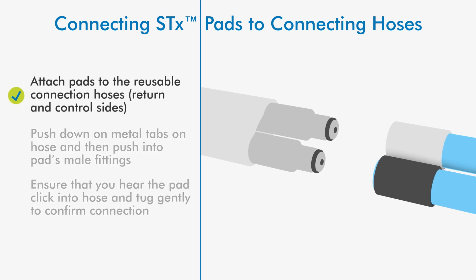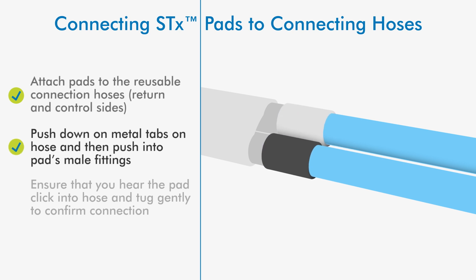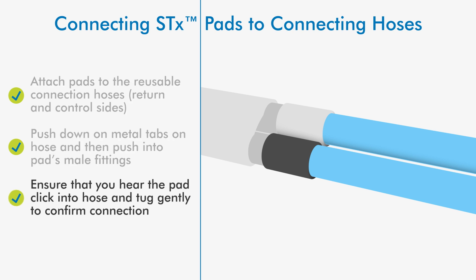Attach pads to the reusable connection hoses. Push down on the metal tabs on the hose and then push into the pad's male fittings. Ensure that you hear the pad click into the hose and tug gently to confirm connection.